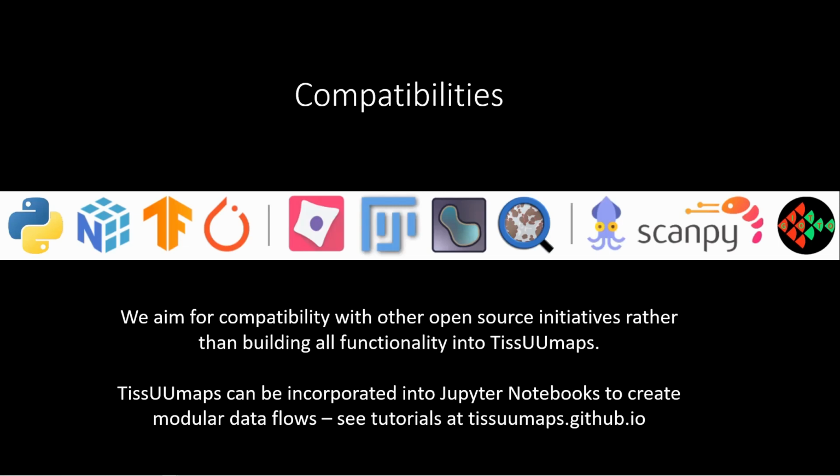And we are not sure we can follow right now. So we focused on AnnData, but if people want to work on integration with more formats, or if OME-Zarr or NGFF formats are a bit more widely used in the future, we might incorporate them also. But right now, TissUUmaps is a research project and we don't really have the time to make it compatible with all formats. Does that answer the question?